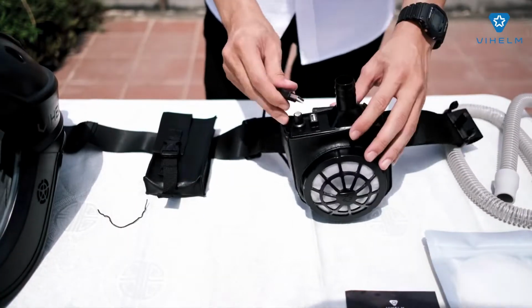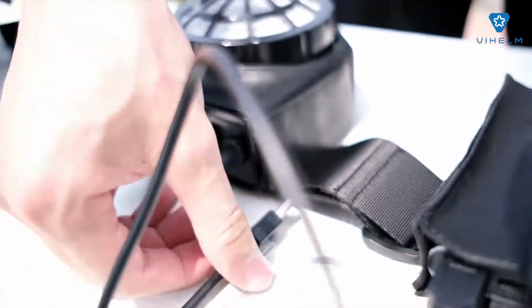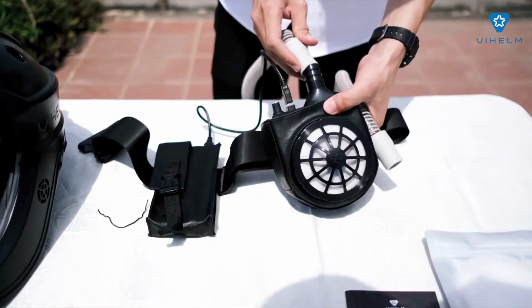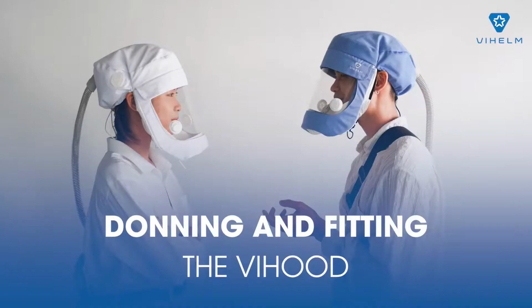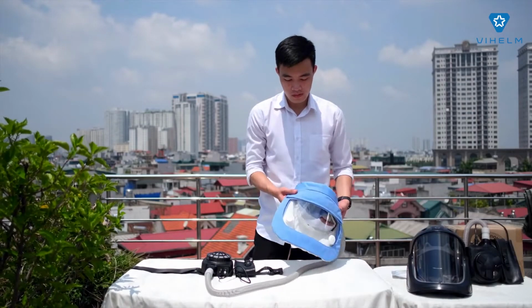Step 2. Plug in the two ends of the USB cable connecting the blower case and the battery. Attach the breathing tube to the blower case and the connector on the Vihood. Donning and fitting the Vihood. After assembling the complete set of Vihood equipment, please follow these steps for usage.